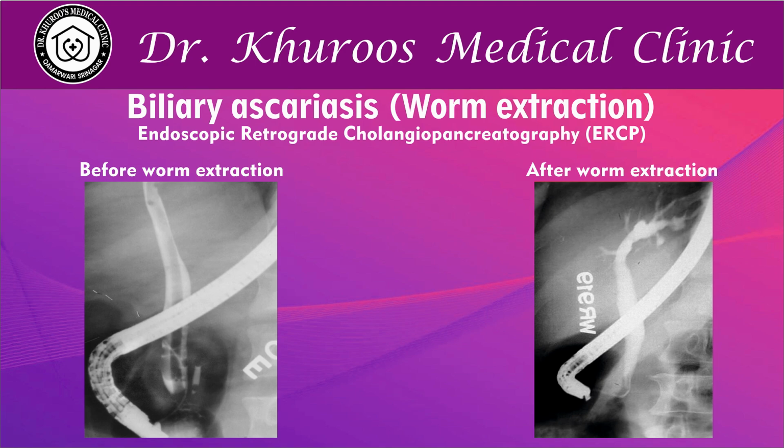Worm extraction at ERCP is a significant therapeutic advance in hepatobiliary and pancreatic ascariasis and is essential in a subgroup of patients with intractable biliary pain, severe cholangitis, and acute pancreatitis.